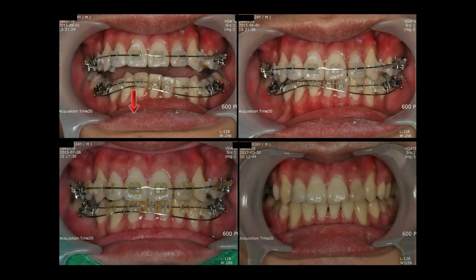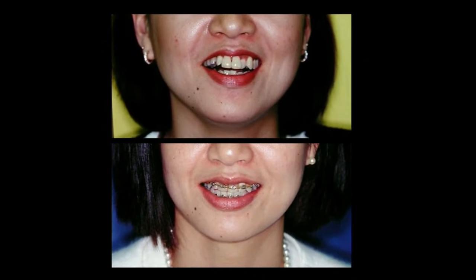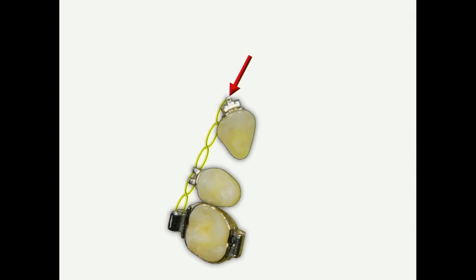For active correction of occlusal plane canting, off-center asymmetric application of intrusion spring is useful, or a combination of intrusion and extrusion arch can be used for canting correction. Now, let's consider side effects on the active unit by associated moments. Retraction force is applied at the labial side.